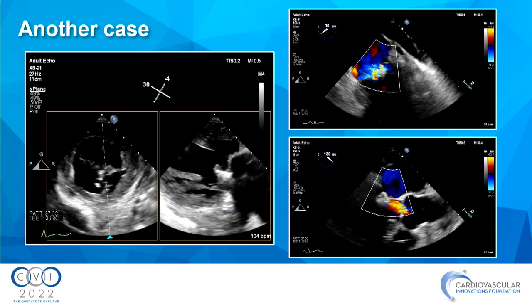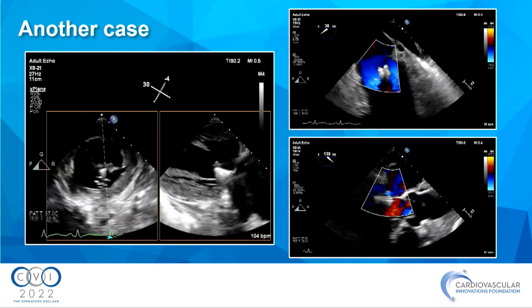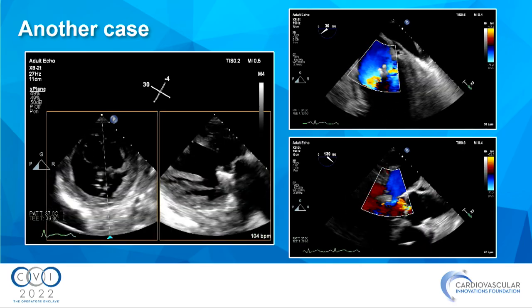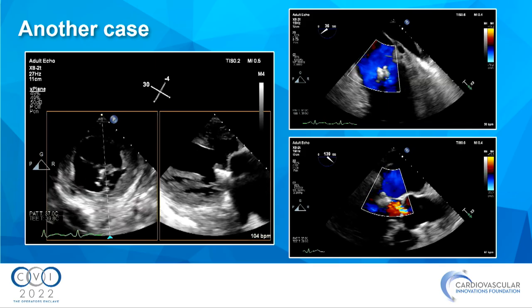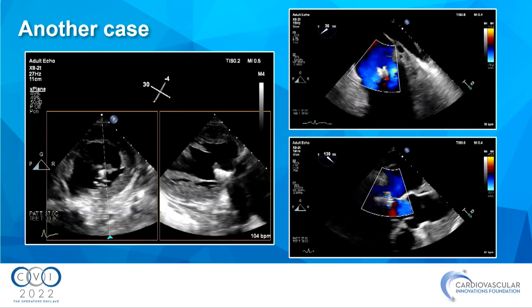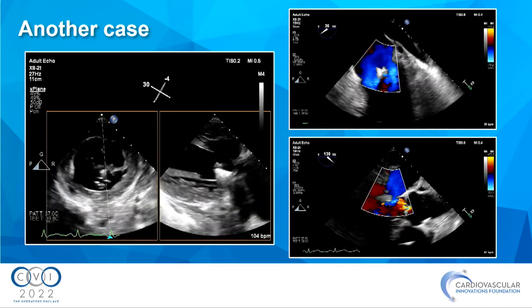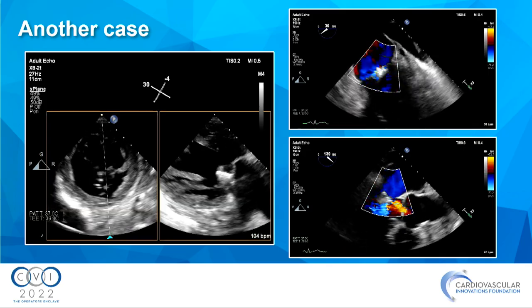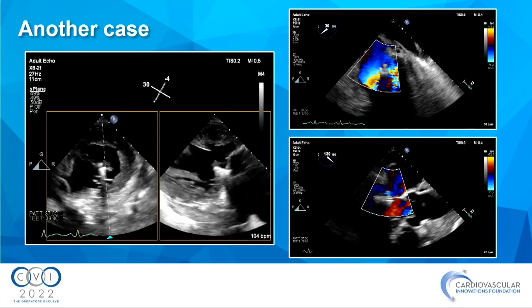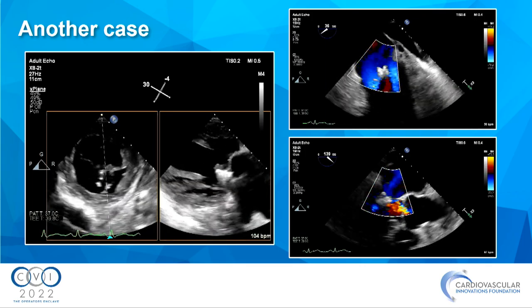But I wanted to show that, and I want to show you another example. This is what I was trying to get to. On the left-hand side, you can see the pap muscle trapped on the LV side. And this is where you hear me on my bandwagon about transcatheter coaptation restoration, not TEER. We're trying to restore the coaptation. If you put the papillary muscle close to where it was originally, the coaptation gets closer. This MR was pretty mild, and this patient did well with no surgery.